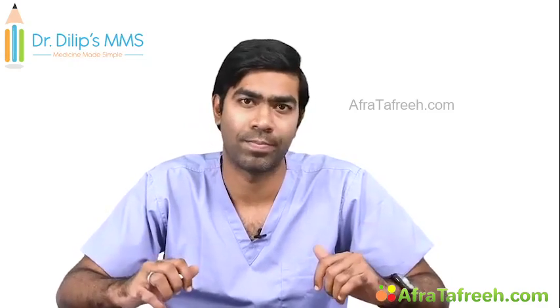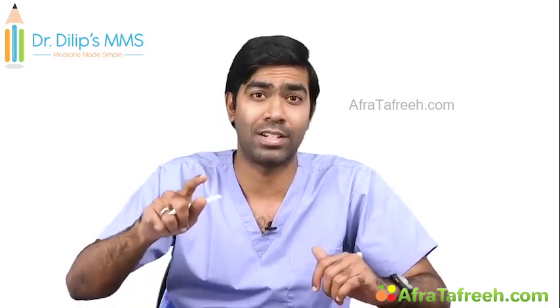in the world. So that's why the name Dr. Archie Brain is very important. He has created a revolution in the supraglottic airways. Remember, the first step you do after failed intubation is a supraglottic airway device, which you'll see again in the chapter on failed intubation.